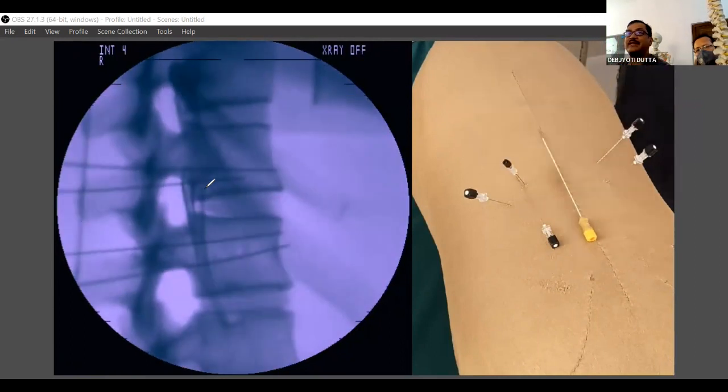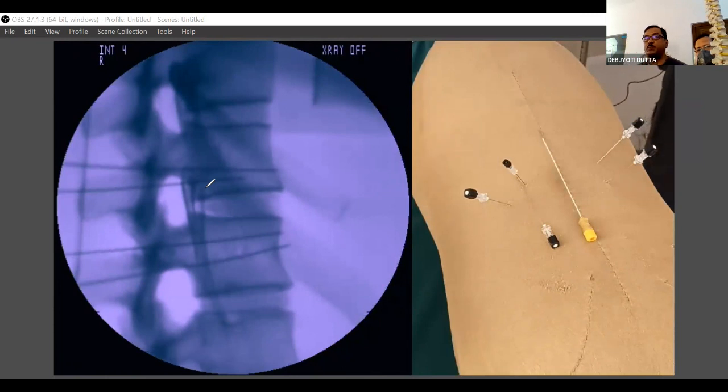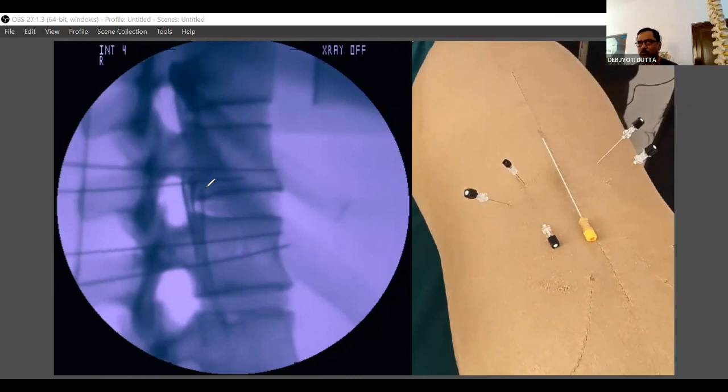This is your Splanchnic. But again, I have to place 4 needles, 2 at the level of T11 and 2 at the level of T12. So you understand, Splanchnic and celiac are almost similar, just a minute difference. And these are the classical approaches of retrocrural and the original Kappis approach, by drawing the different triangles.